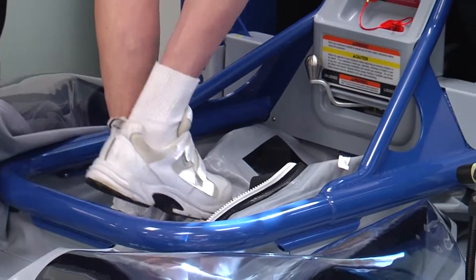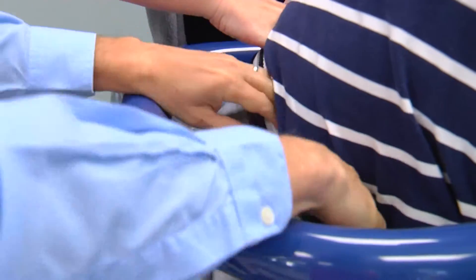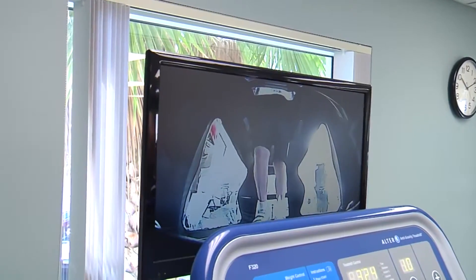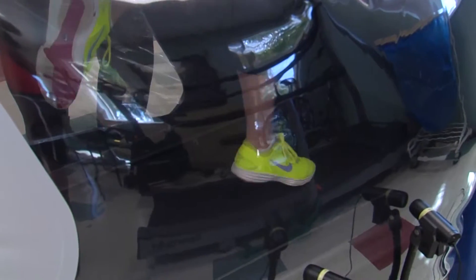Here's how it works. In a system developed by NASA, someone is zipped into the AlterG and the airlock is pressurized. It serves to lower their body weight, going as low as 20 percent of their actual weight, reducing stress on joints and muscles.